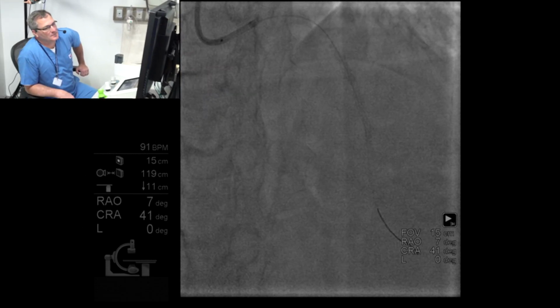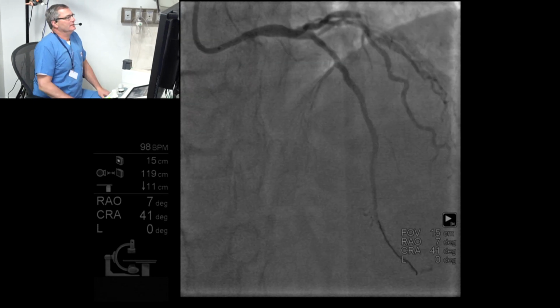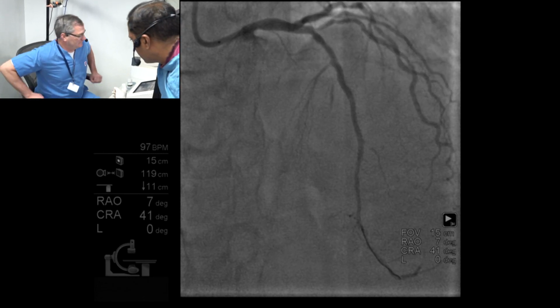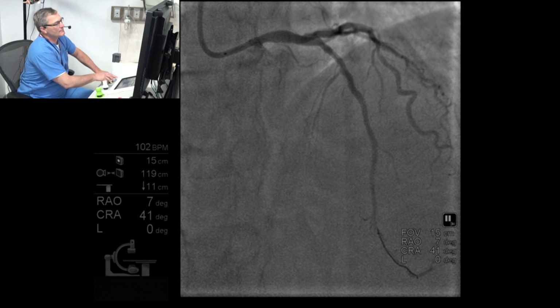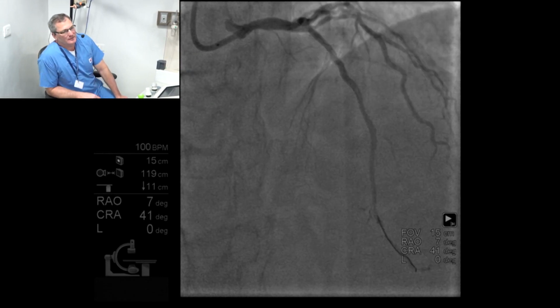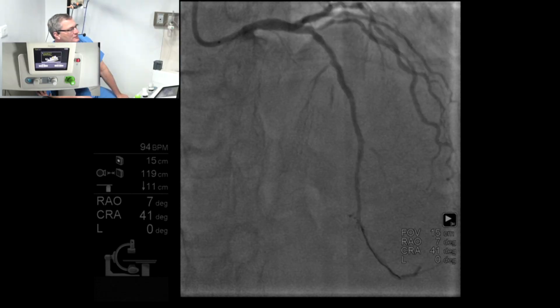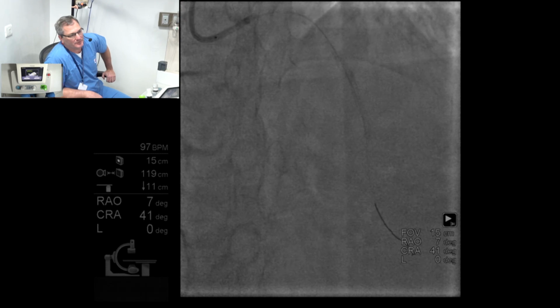Yeah. But why can't we do an OCT and see? Let's do it. So what do people think of this? I didn't see this on the pre-film, but just after the septal perforator, you see this late filling. When you replay, you see this? That septal. Yeah, but I didn't see that before, so we've presumably opened that up, or hopefully it's just another septal that we had to see. If she's having pain, yeah, but I think if she's okay, he or she, I don't know if this is a he or she. He.